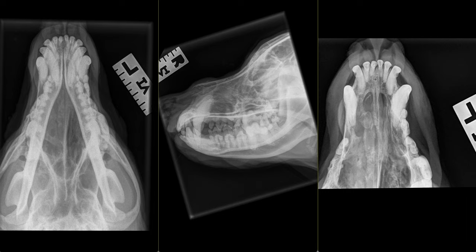A mass lesion present within the right nasal passage is prioritized. However, we cannot fully describe the extent on radiographs alone. Computed tomography can be excessively useful as it will help us define the degree of lysis as well as the extent of the mass. A neoplastic process is our primary differential and includes nasal adenocarcinoma, squamous cell carcinoma, and melanoma. A tooth root abscess arising from tooth 104 with secondary osteomyelitis is considered less likely given the more rostral location of the soft tissue opacity in the nasal cavity.